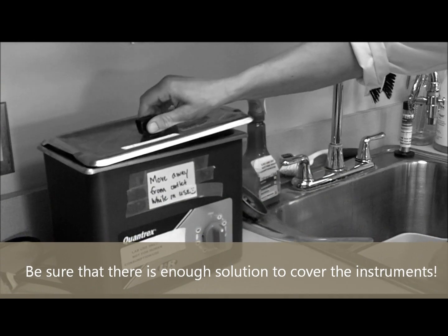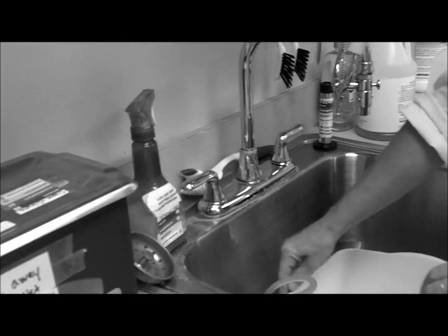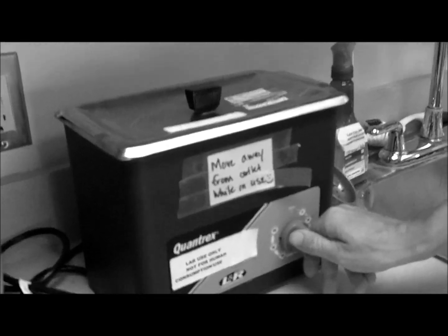Ultrasonic cleaner? How do we work that? You put the instruments in, the lid on, the hose is clamped and in the sink, and then you set it for 15 minutes.